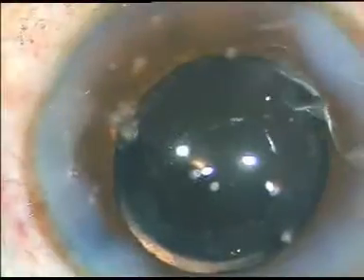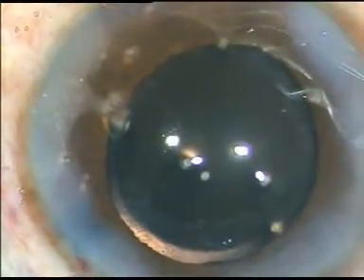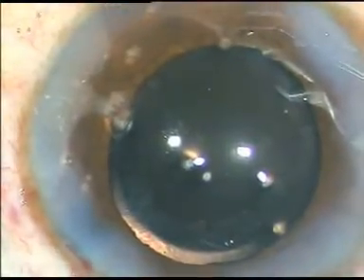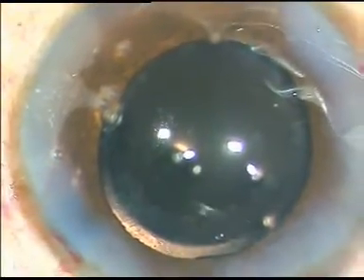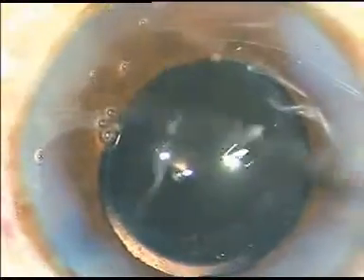And a final wash is given with balanced salt solution. I do the surgery with ringer lactate and I do the final wash with balanced salt solution. Thus the surgery becomes economical. BSS is about 5 times costlier than ringer lactate.